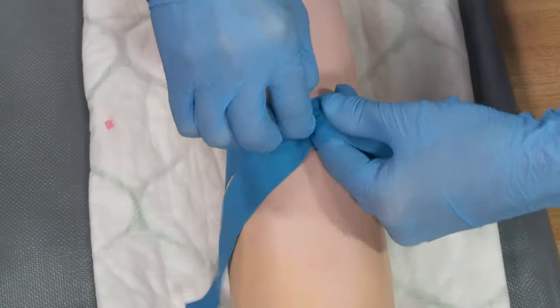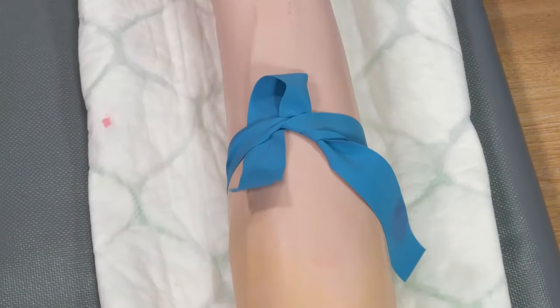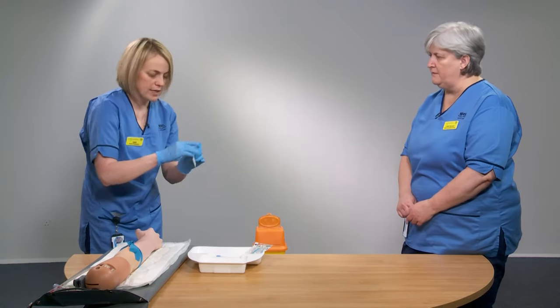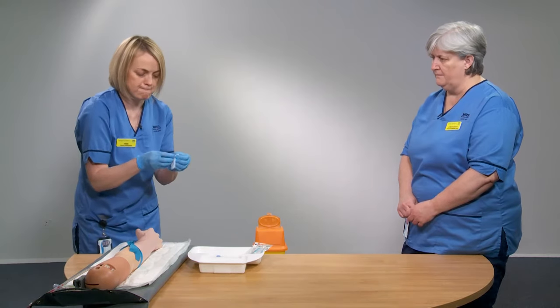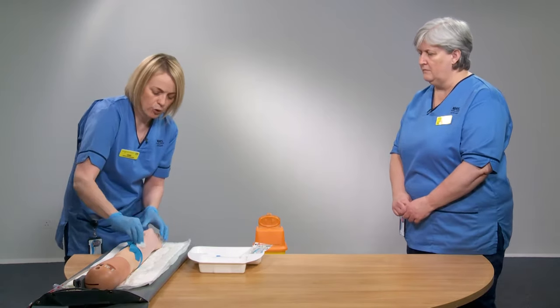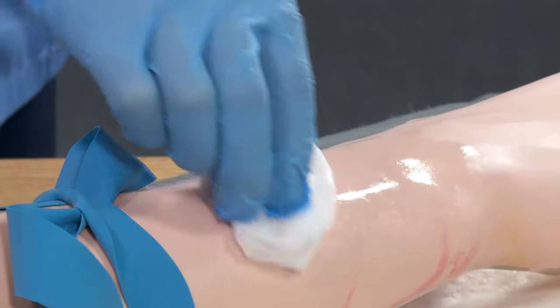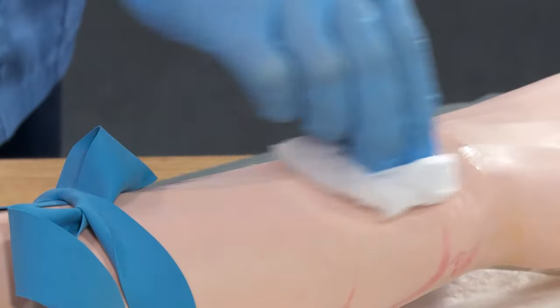Tie the tourniquet so it's easy to release at the end of the procedure — you'll have two wings hanging out on one side. Once you're happy with the vein, give the area a thorough clean with your clinical wipe. Clean not only over the vein but also the surrounding area to decontaminate the site, working up and down and then side to side.